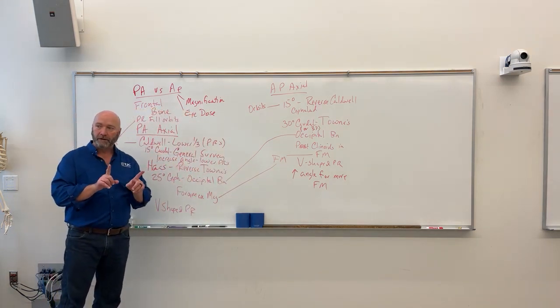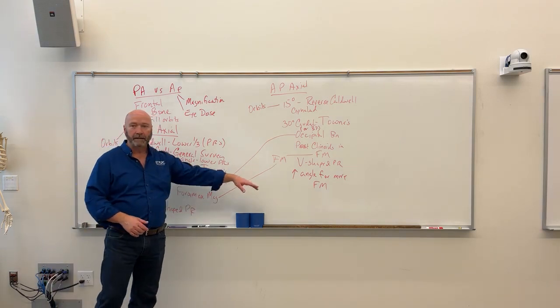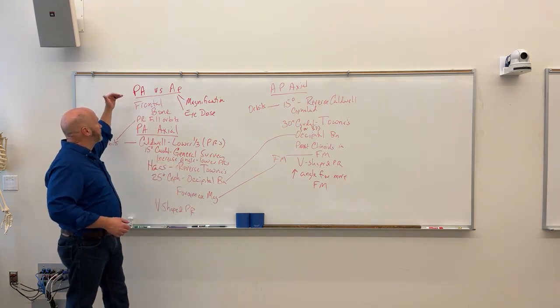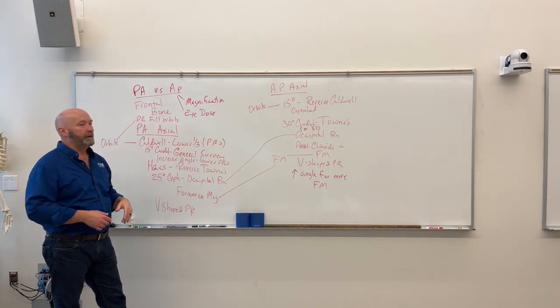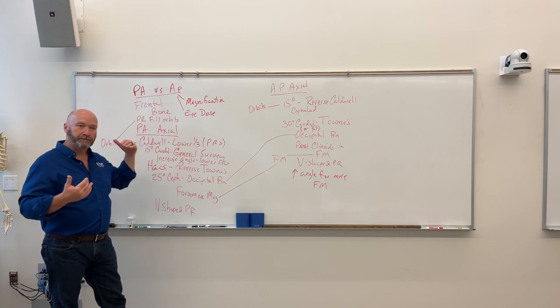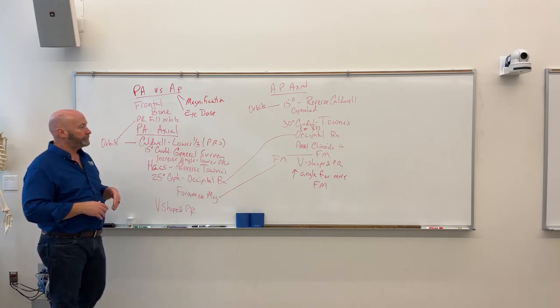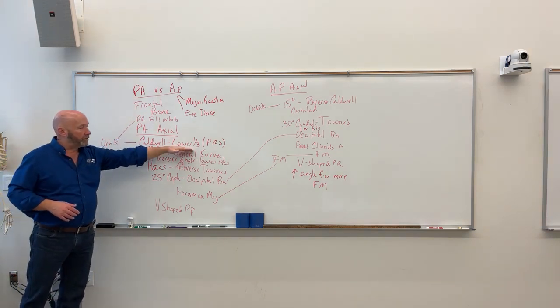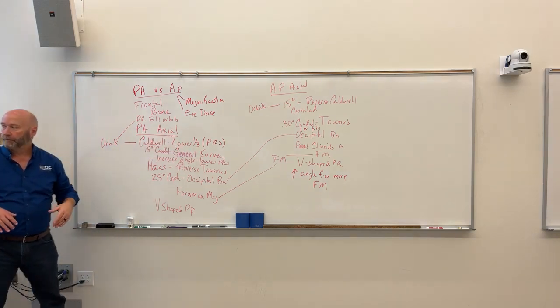You're going to look for the V shape of those petrous ridges. You're going to look for questions that mention the foramen magnum and don't mention the orbits. What we're going to look for difference between the PA and AP and the Caldwells is the position of the petrous ridges inside of the orbit. 15 degrees pushes them down in the lower third, right? So naturally, completely fill the orbit, lower third. If we increase the angulation, then they're just going to keep on moving, right?